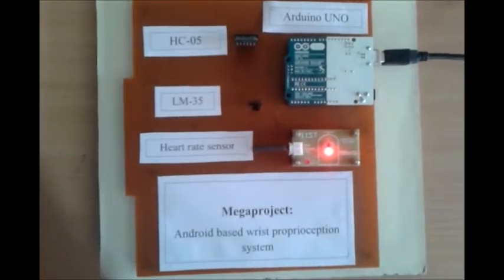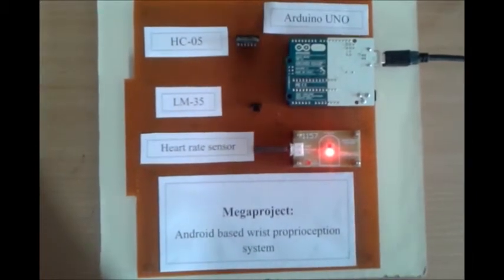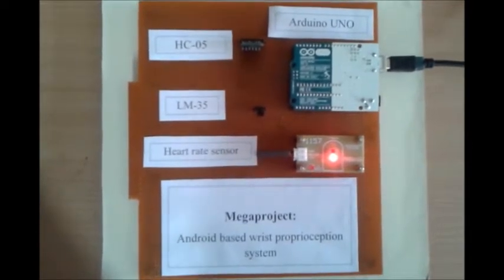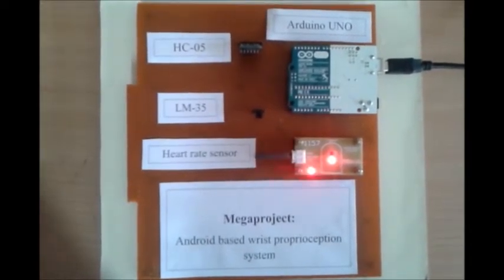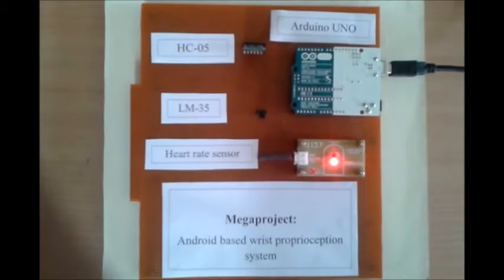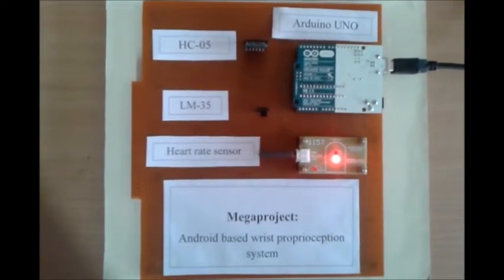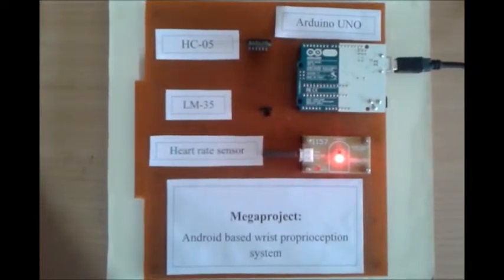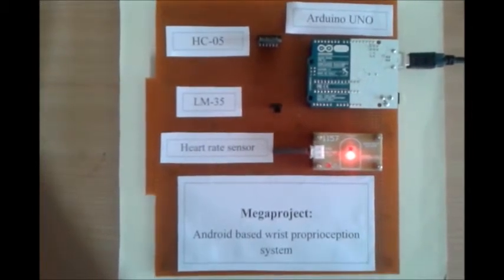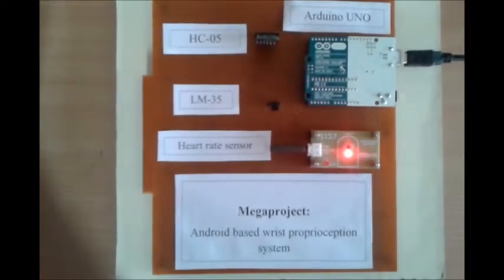Okay, let us come to the flow of our project. We have used LM35 as a temperature sensor and a heartbeat sensor 1157. LM35 senses the temperature in degrees Celsius. For every degree rise in temperature, it gives a change of 10 millivolt in output. It is a 3-pin sensor. The 3 pins are VCC, output and the ground. The heart rate sensor is dependent on the principle of light modulation by blood flow through the finger at each pulse. Oxygen in blood absorbs the IR rays, so the reflection of IR rays varies. The sensor gives an inverting output and produces a TTL output.